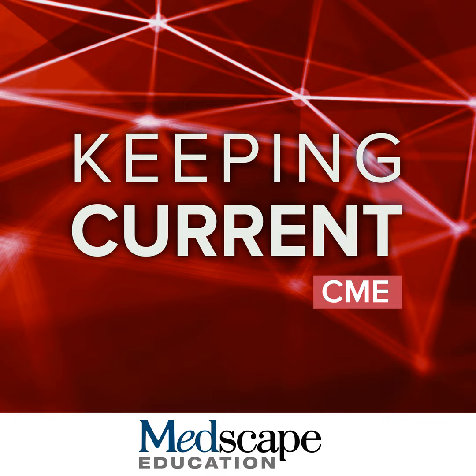Where the issue may come in is when we look at flash filling hemangiomas. You can see here a flash filling hemangioma versus a small HCC with extracellular contrast agent; it is fairly easy to tell them apart. By 5 minutes, the hemangioma retains contrast, the small HCC washes out. The same two cases with gadoxetate, you can see that it becomes very difficult because of pseudo washout and hepatobiliary phase. It actually becomes impossible to tell them apart. So if you suspect hemangioma ahead of time, you should not use gadoxetate. If you do see hemangioma because you got gadoxetate for other reasons, remember, look for typical enhancement pattern and make sure that enhancing components are similar to blood on all phases.